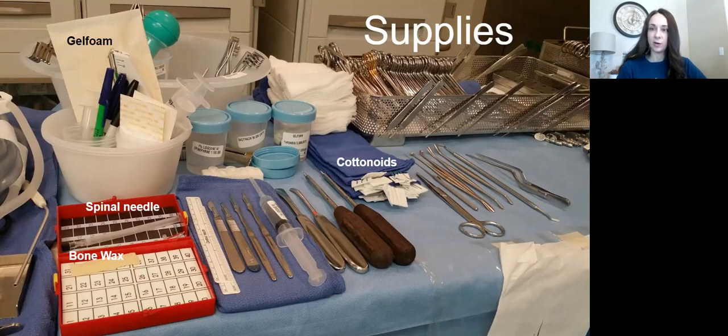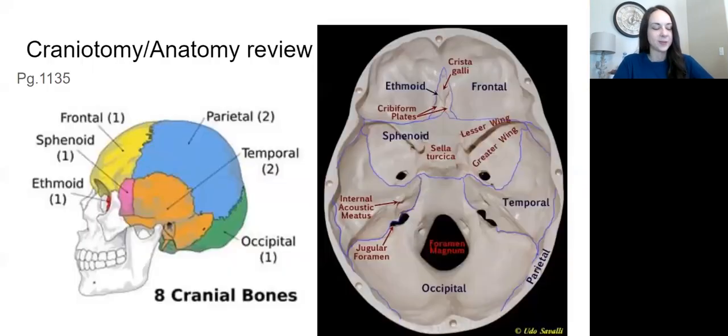Ultrasound. You always want to have ultrasound available in the room for these. I kind of compare it to vascular. There's lots of vascular structures, so they may want a handheld ultrasound in there so that they can see what's going on with the patient. And the medications I talked about. So those are some of your supplies. The rest I will hit in the surgical procedures.